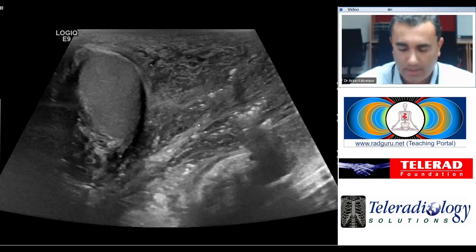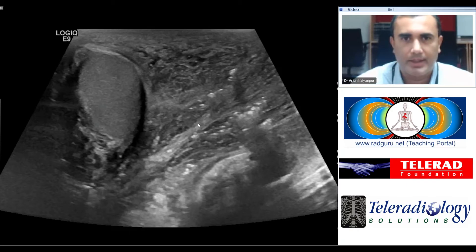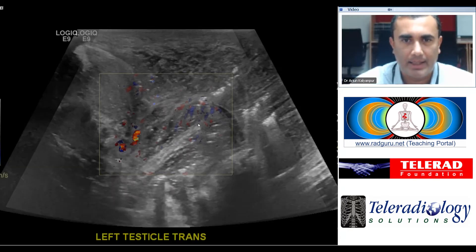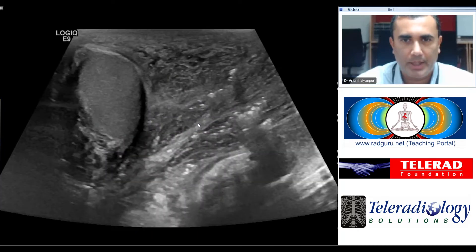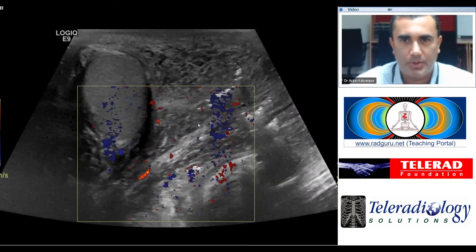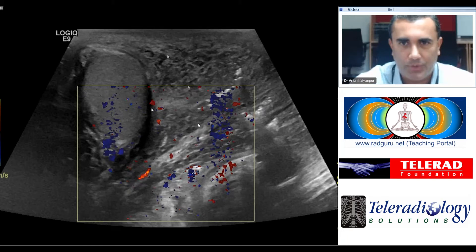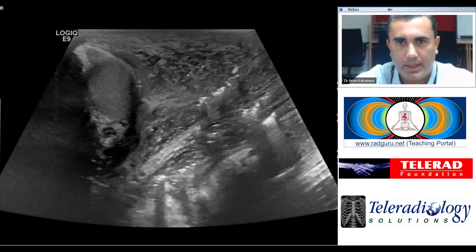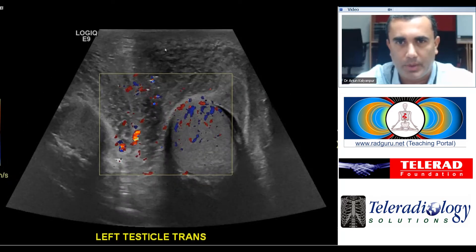Here's a scrotal sonogram of a patient presenting to the emergency room with significant scrotal swelling and pain. As we pan through the images, we can see that there is a tremendous amount of scrotal wall edema, represented by these hypoechoic areas or pockets of fluid within the scrotal wall.